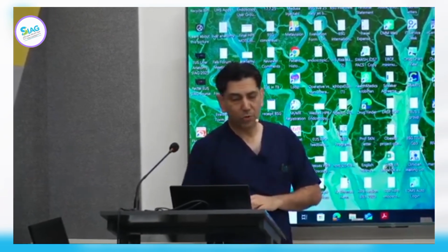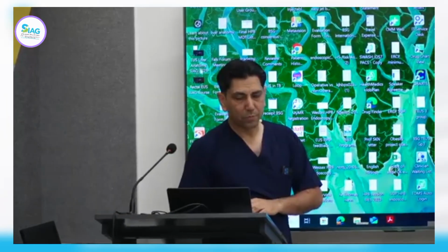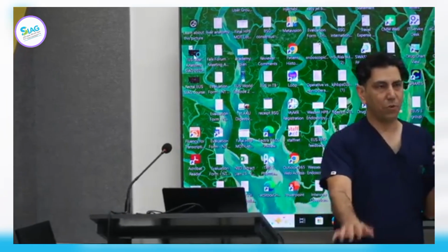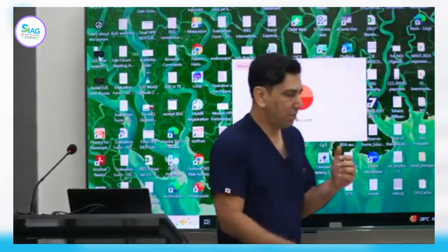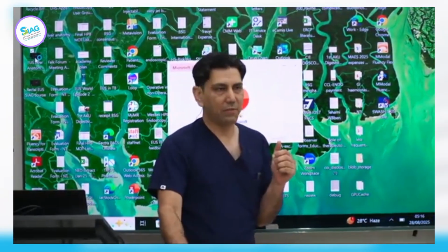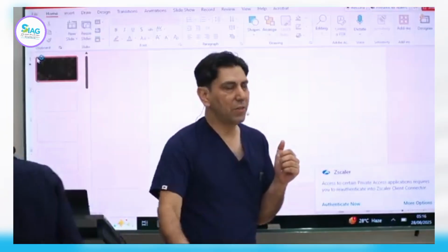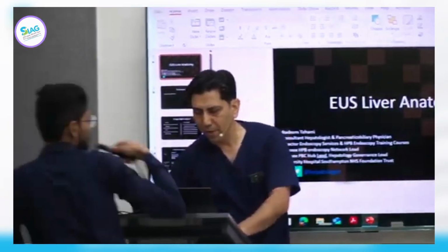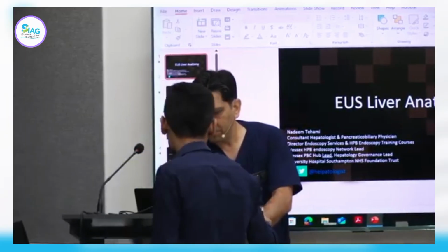In your own setup, you should try to arrange it such that the whole system, the panel, is on your right here. So in our system, we've got the patient's head. That's how we are scoping, and then the whole Arietta system is right in front of us. So we can change the images, we can change the harmonics, we can change whatever we want to.